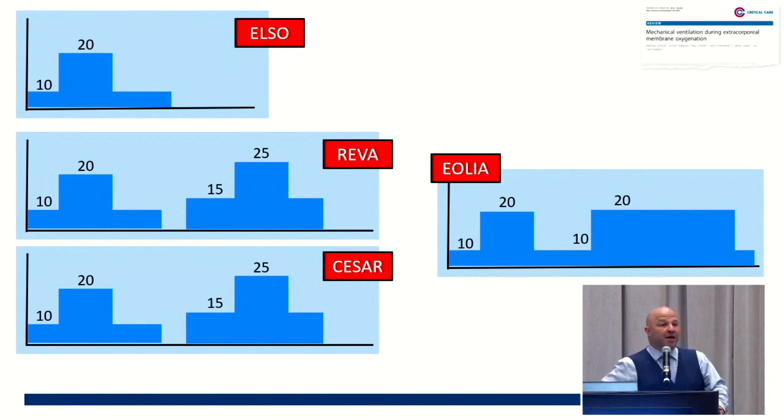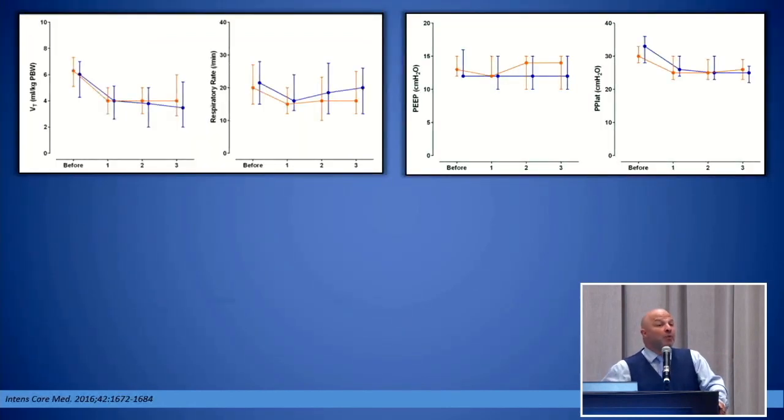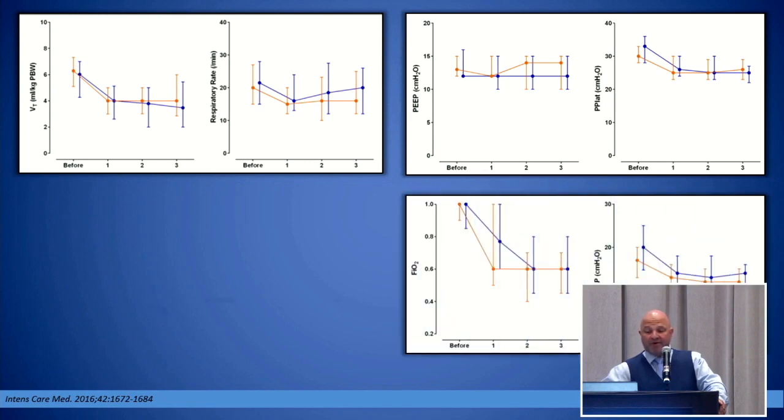I will point out that if you're going to do this, you're kind of checking those boxes with the PEEP and atelectrauma and volutrauma, as well as the driving pressure here, right? And so those are all good ideas, and it comes forward here with a pretty large individual patient meta-analysis that was looking at, well, what is it that is associated with better outcomes in these particular patients? The first couple graphs that you see here, there's no difference, the orange being survivors of ECMO, the blue being people that died, and you can see that there's no real difference between those different parameters. However, if I put up driving pressure, you see it starts to separate itself.